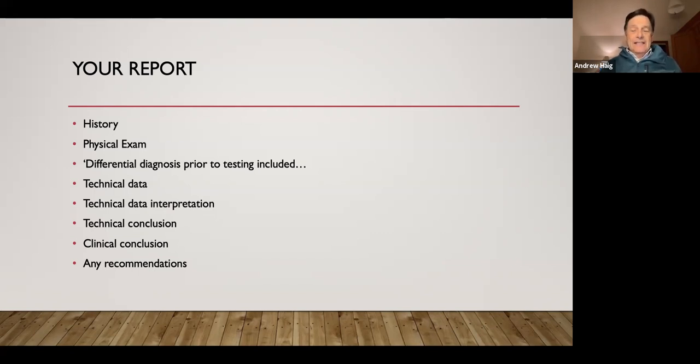I had a lady last week who fell on both of her wrists and had a bad median mononeuropathy at the wrist on both sides. It wasn't a compressive neuropathy. She smashed it. And doing carpal tunnel release would have been stupid. So the technical result of an EMG is median mononeuropathy at the wrist. The clinical conclusion is carpal tunnel. Gosh, it sounds like carpal tunnel syndrome to me. It doesn't sound like she has a ganglion cyst or something like that, right?